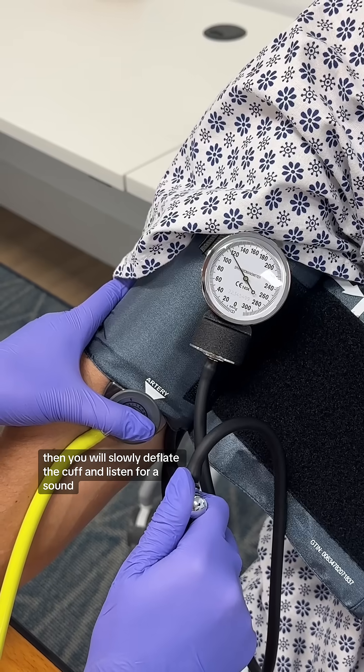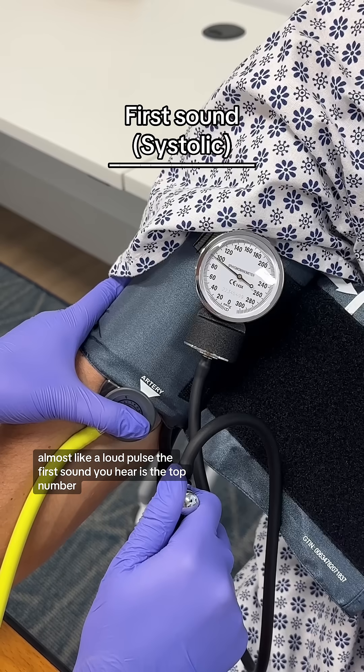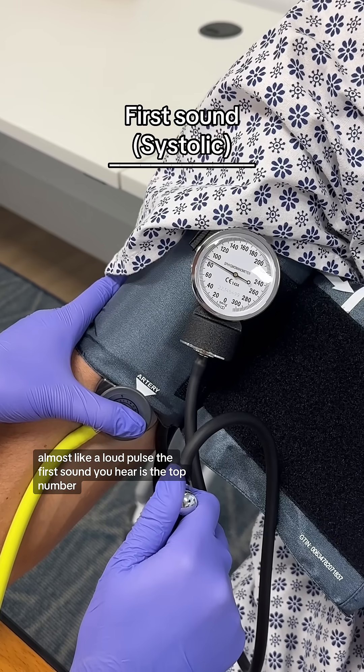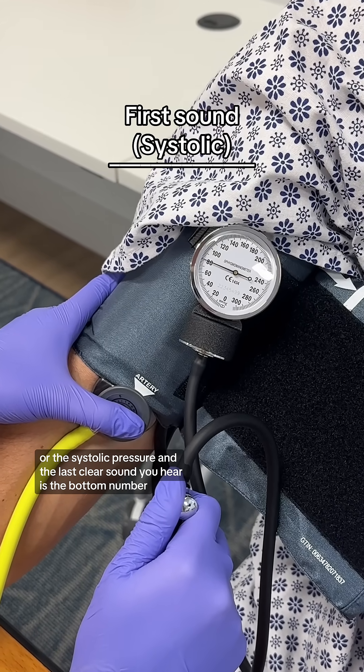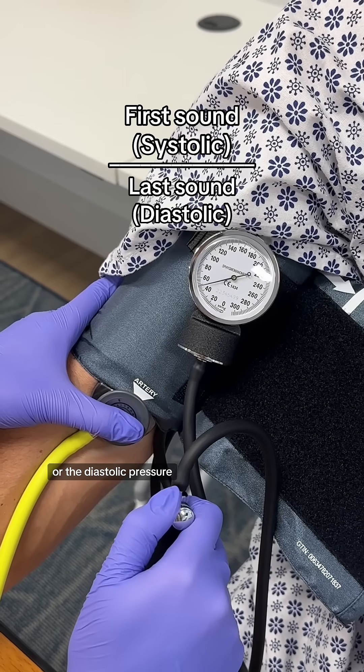Then you will slowly deflate the cuff and listen for a sound almost like a loud pulse. The first sound you hear is the top number, or the systolic pressure. The last clear sound you hear is the bottom number, or the diastolic pressure.